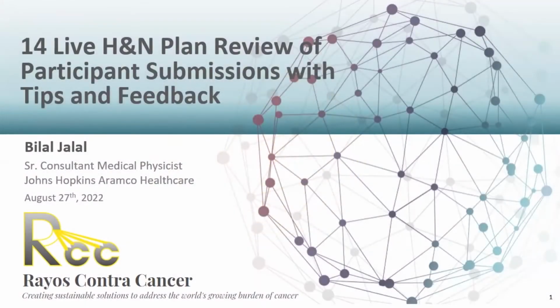Basically, today we are talking about the live view of the participant submission with the plans, and we get the feedback. But I'll try my best not to make it a boring session. There will be some questions during the presentation and the live demonstration.